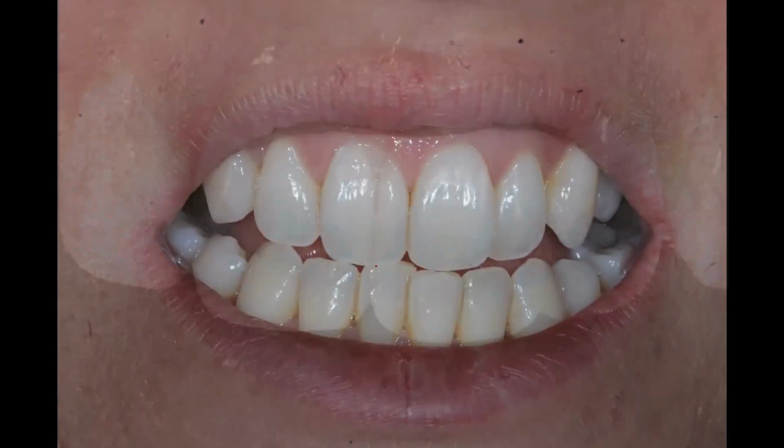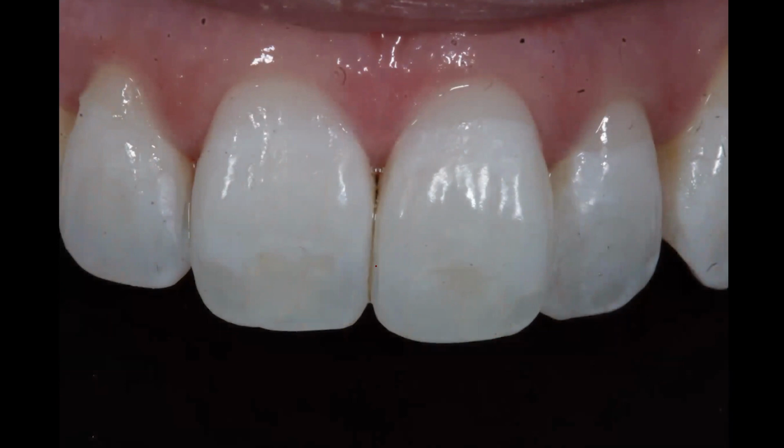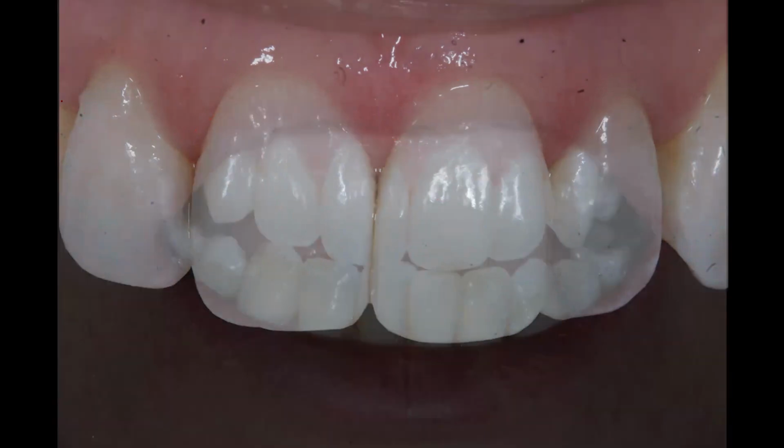And you can see actually as well, just the effect of desiccation on the tooth. This area is a much different color to this area because the rubber dam didn't actually come all the way over. I didn't invert it all the way. There's a little bit of excess here as well, which I polished off afterwards in terms of the infiltrant. So yeah, those are a few flaws in the rubber dam, but we had enough isolation to do what we wanted to do for this case.